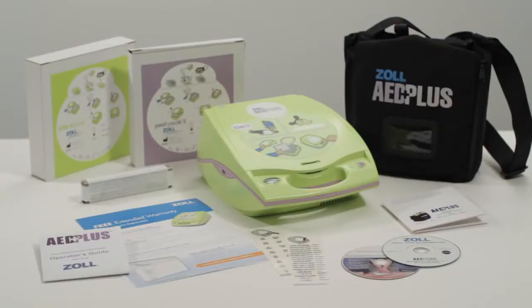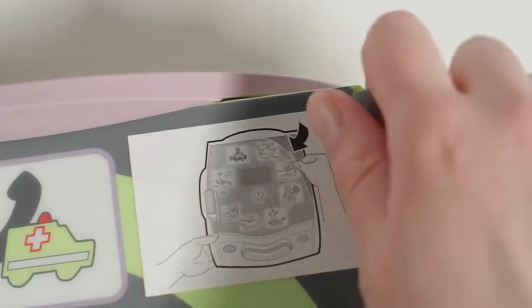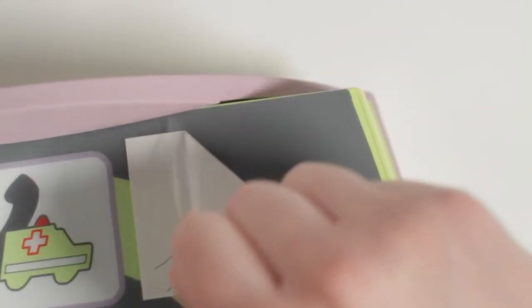Now that we have checked to see that everything has been delivered, we'll prepare our AED Plus for use. Begin by removing the clear protective covering on the face of your AED Plus. Pull the tab with arrows on it to the left and down across the face of the unit.